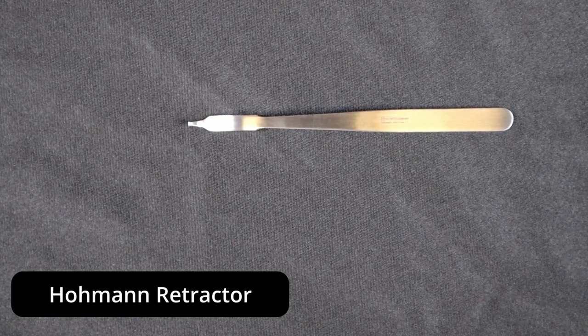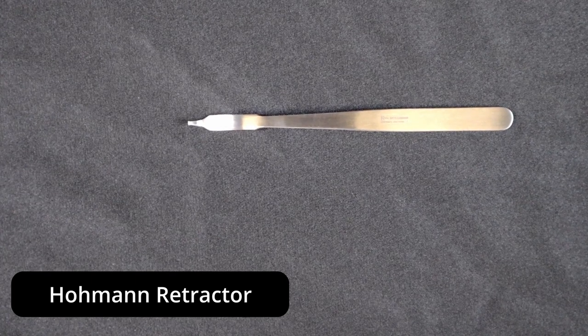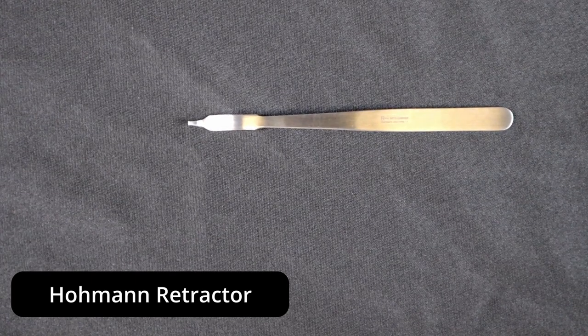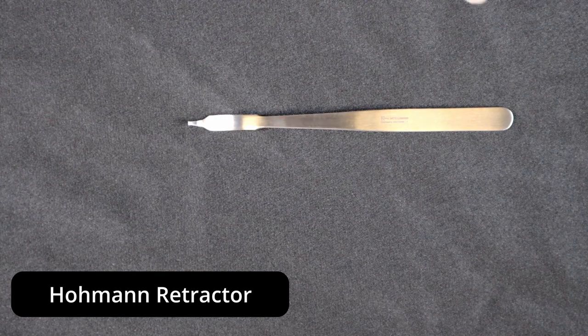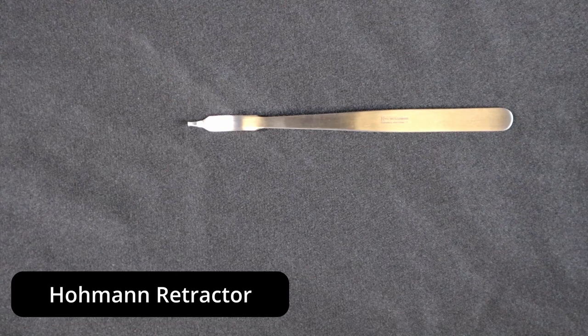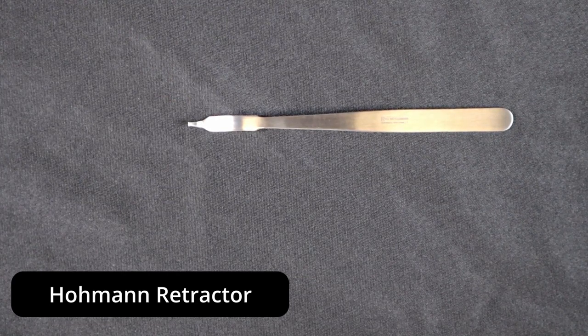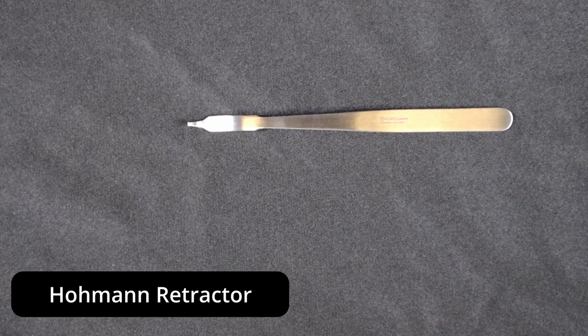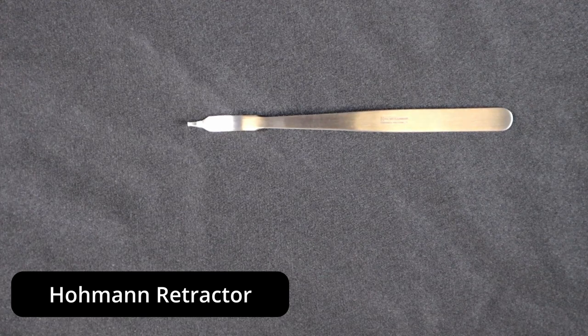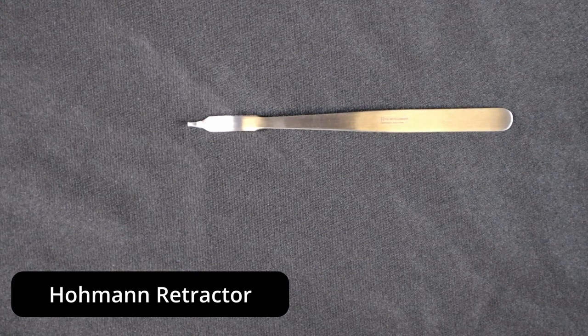All right, again, the one we're looking at today is a short-tipped eight millimeter blade, six and a quarter inches long. That's all for this episode of Hello My Name Is, and that is the Hohmann retractor. Thank you for tuning in again, and until next time, keep fighting dirty.